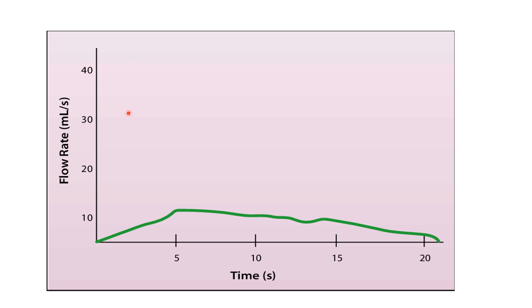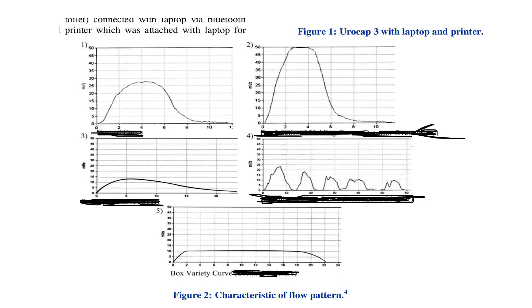I will be showing certain normal and abnormal graphs. I have hidden the diseases or pathology behind these graphs so we can differentiate which is normal and which has some kind of abnormality. This first graph is a normal graph with a normal bell-shaped curve, with a voiding flow rate of around 20 to 25 ml per second over a time period of approximately 10 seconds.